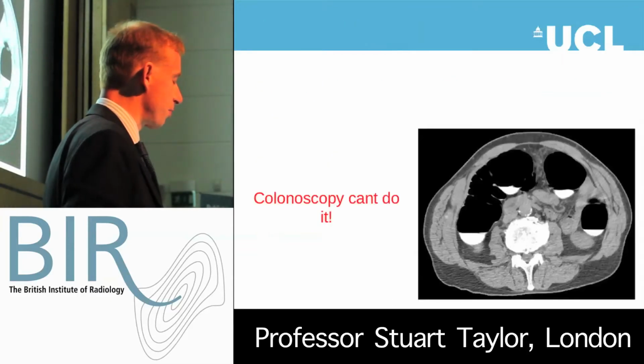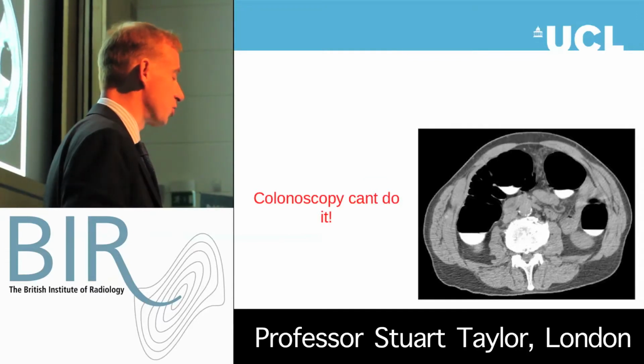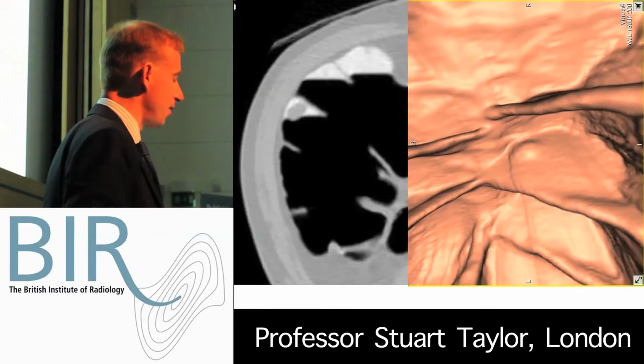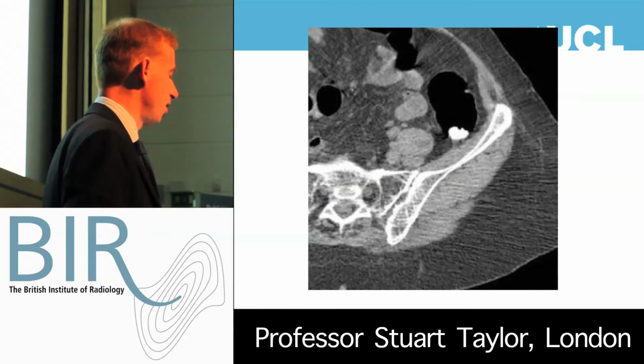So you give some oral barium or gastrografin probably, or some iodinated contrast. The liquid in the colon turns white, so you can see it very easily. As I say, you can halve or even eliminate laxatives by doing that, which the endoscopists can't do. And you can see the polyps submerged in the tagged fluid, so you get a diagnostic advantage. And clearly you're not going to call this a false positive polyp because it's very bright and highly tagged. This is tagged fecal residue.